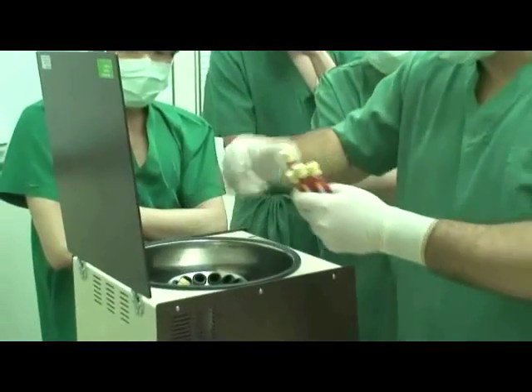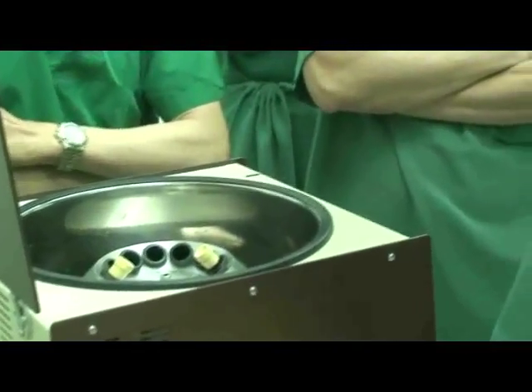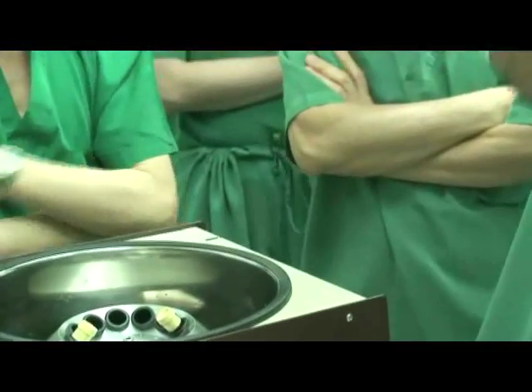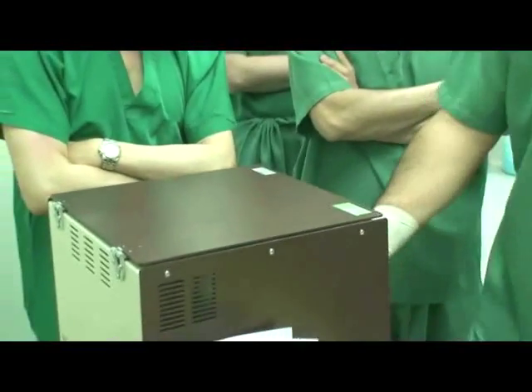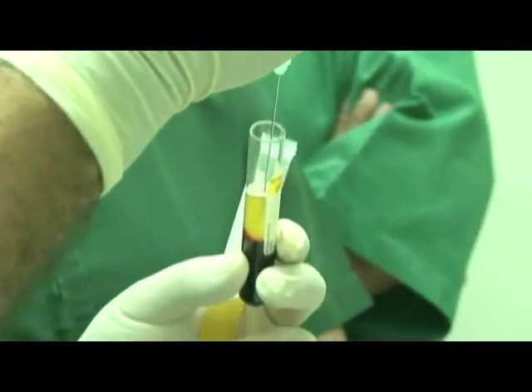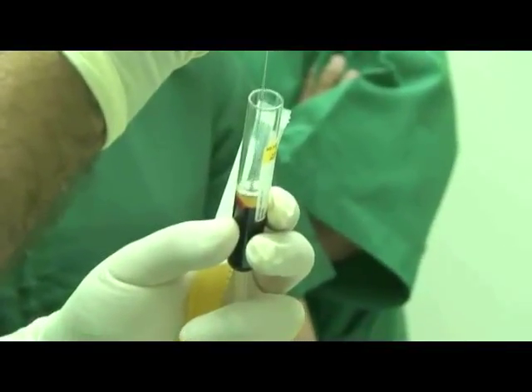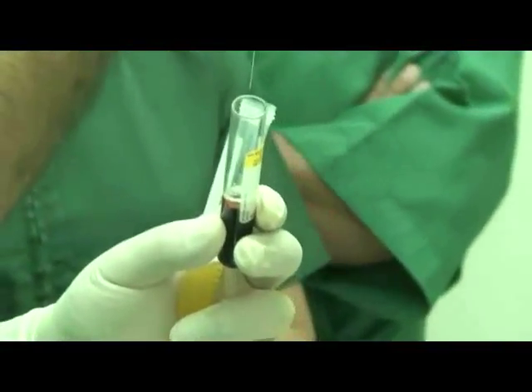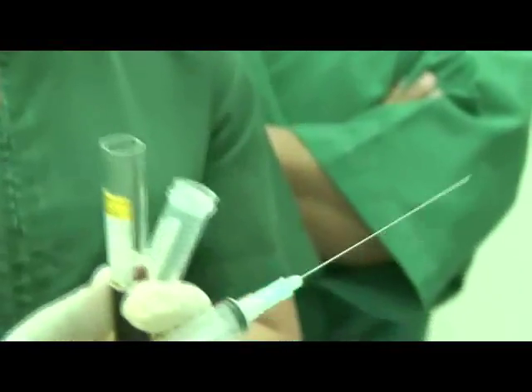Insert the 6 blood collection tubes into the centrifuge and spin at a low speed. Using a spinal needle, draw out the clear PRP liquid at the top of the tube and inject into two new 15 milliliter centrifuge tubes.